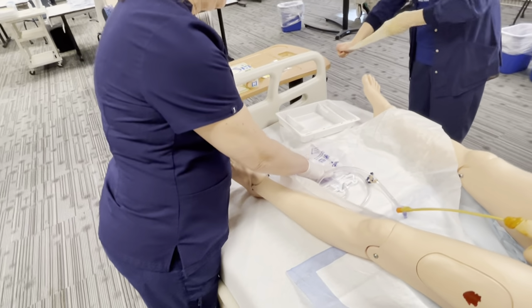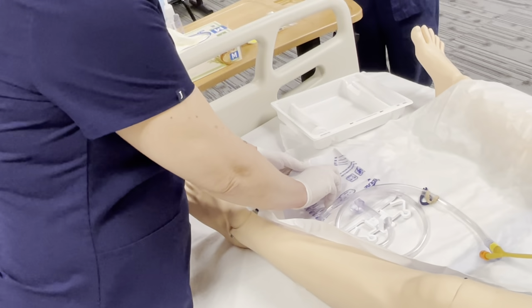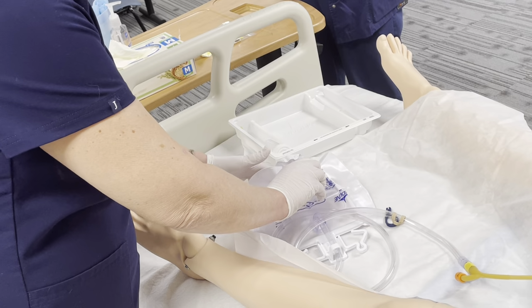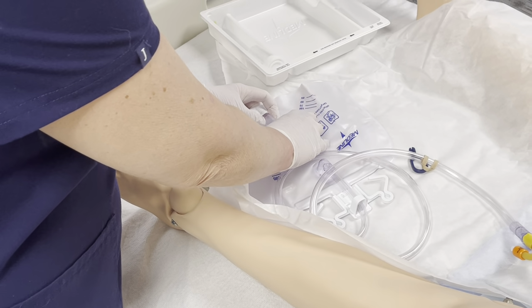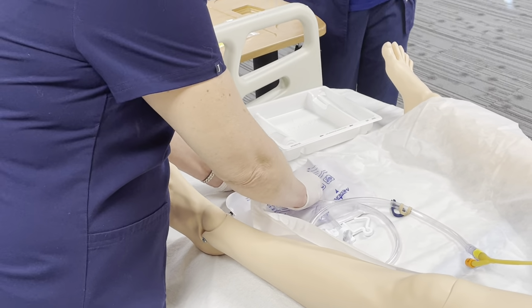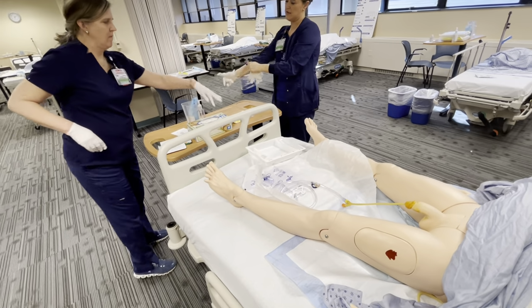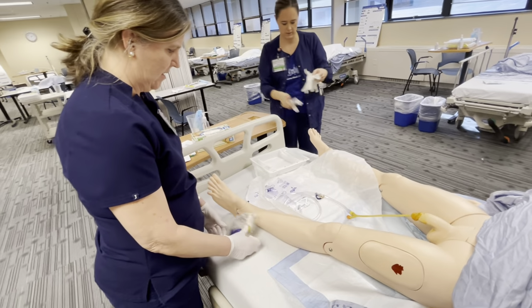I'm unfolding the catheter bag, and then I'm going to prime the bag by opening the connection and separating that bag to get an air pocket in there. Why do you have to do that? So it helps the Foley bag drain. And then I'm going to close it. Yes, I've heard with these new kits, if we don't do that, then the urine has a hard time draining. So we want to make sure we vent the bag.